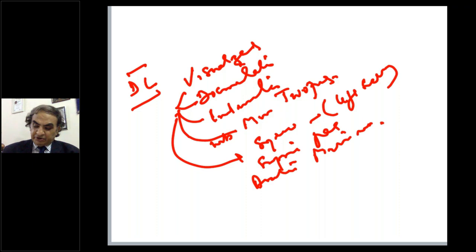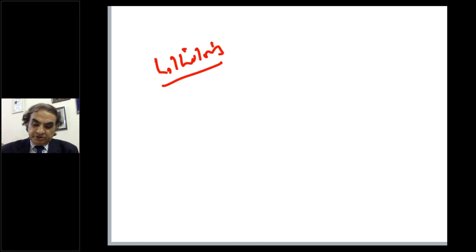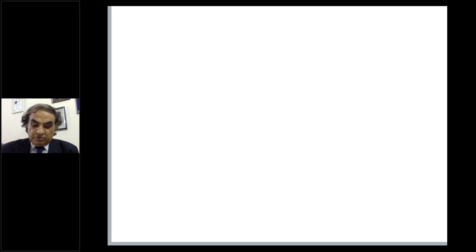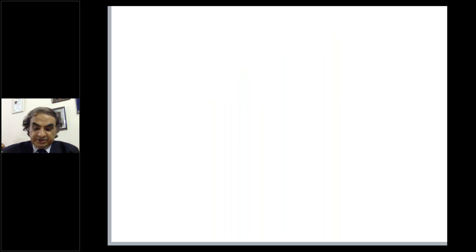Sometimes, especially in gynecological procedures, you put the patient in lithotomy from the very beginning. Then the assistant can stand in between the legs. For pelvic procedures or below the umbilicus, you need a Trendelenburg position, and for the ones above, we use a reverse Trendelenburg position. We follow the SAGES or the SALS recommendations. We should localize the biopsy site, but biopsy at the end.